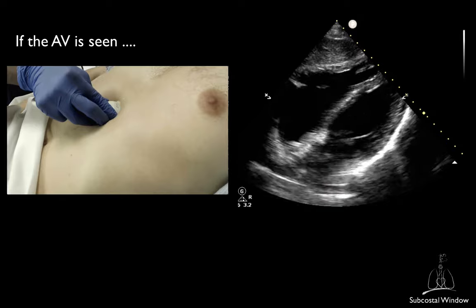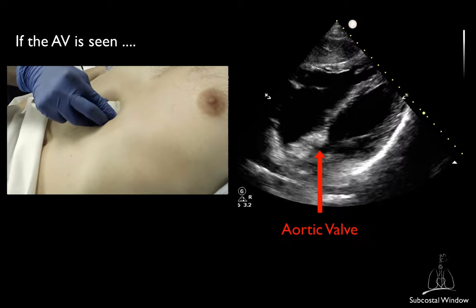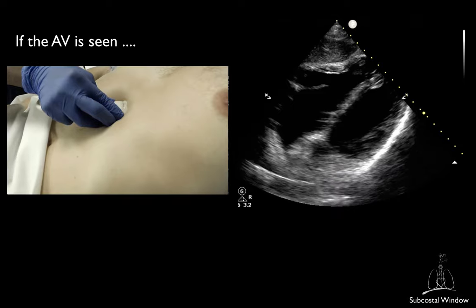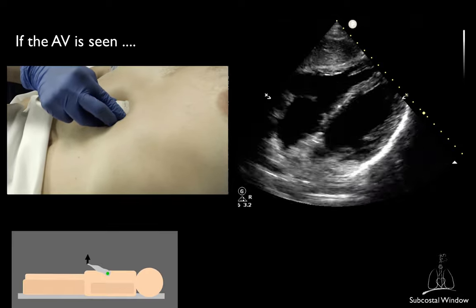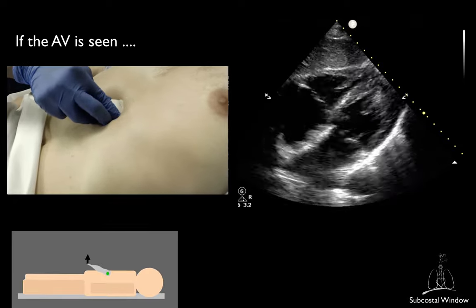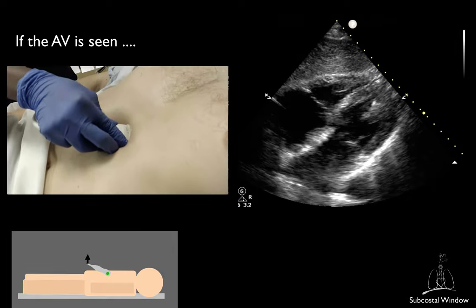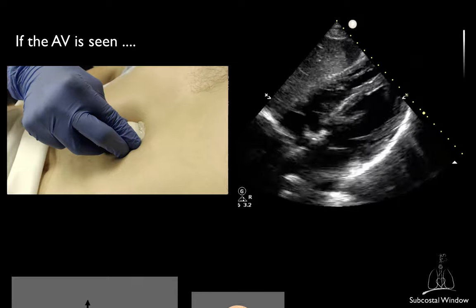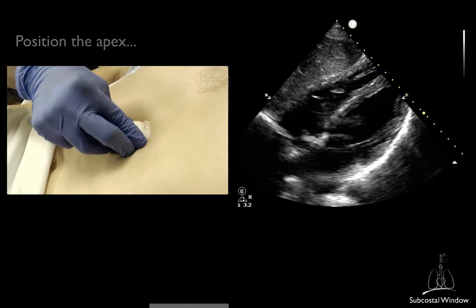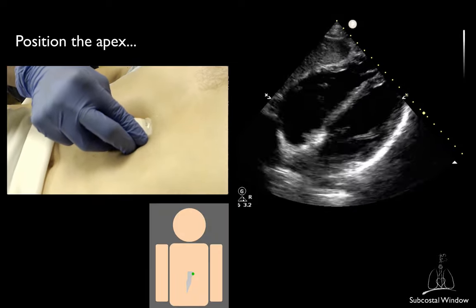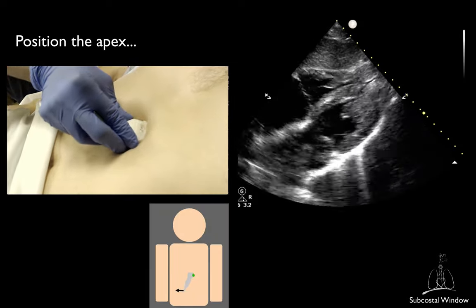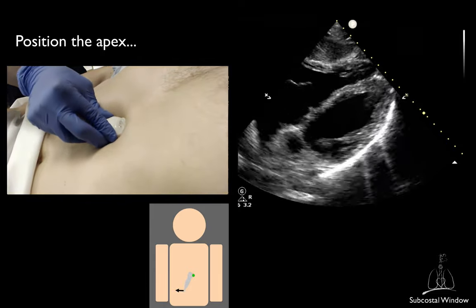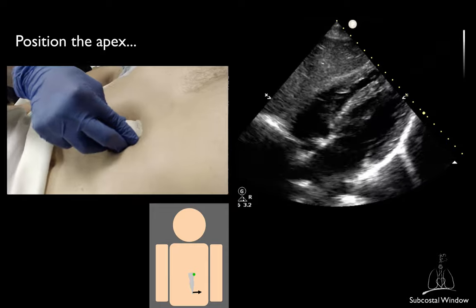If the aortic valve is seen, it means that you are looking too anteriorly. To correct this, you will have to lift the tail up to look more posteriorly. This may not be sufficient and you may have to also rotate slightly counterclockwise. To bring the apex more in the middle, bring the tail towards the right of the patient. To bring the right atrium in the middle, bring the tail end towards the left of the patient.